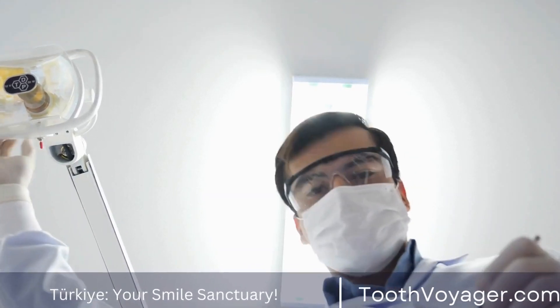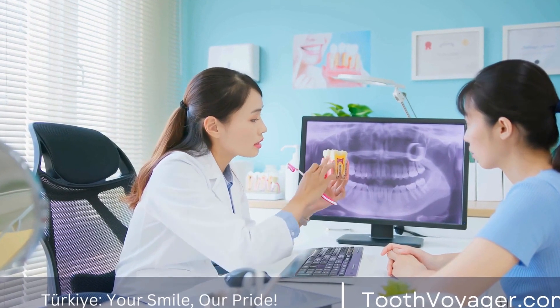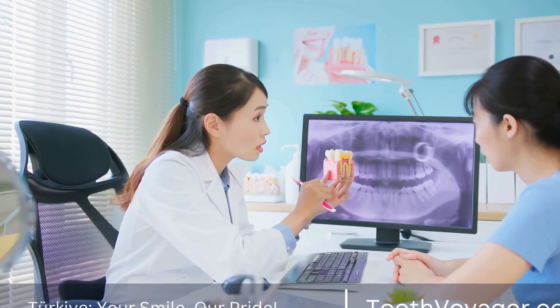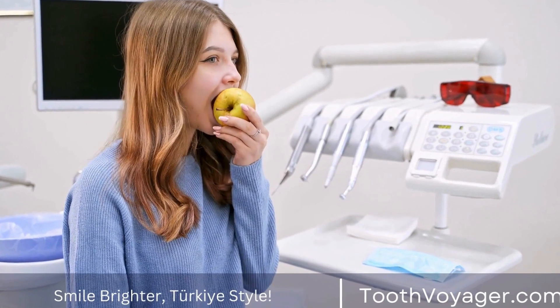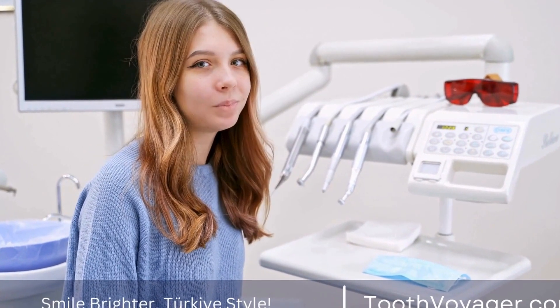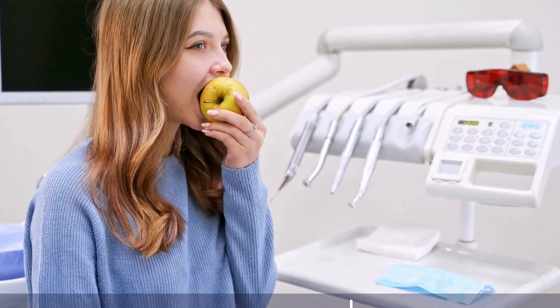The Importance of Customization. Each patient's mouth is unique, which is why custom dental crowns are essential for successful restoration. Unlike pre-made crowns that come in standard sizes, custom crowns are individually crafted to match the patient's specific tooth shape and color.